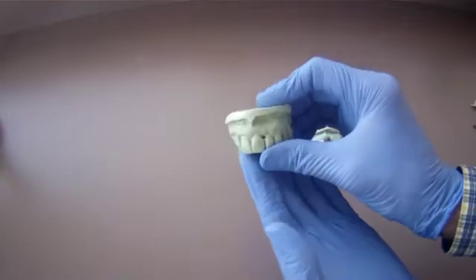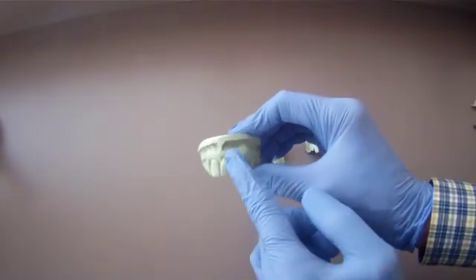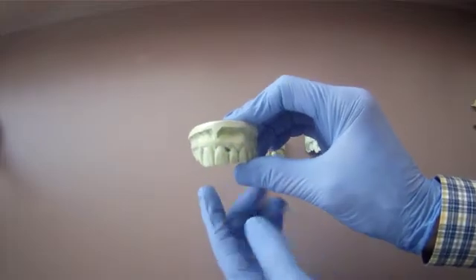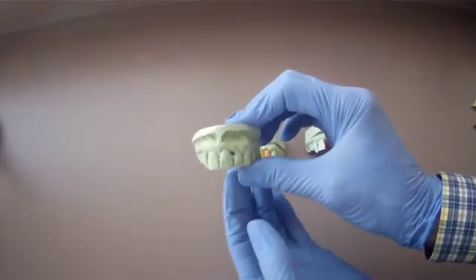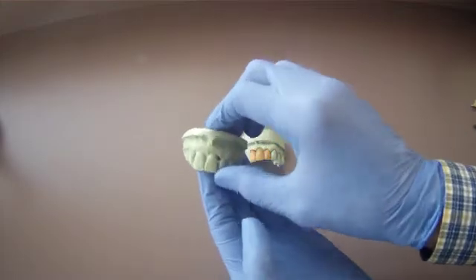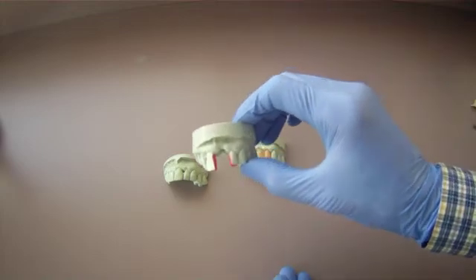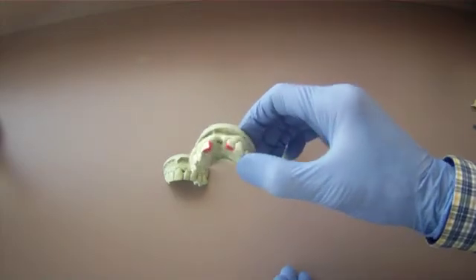This gentleman came into our office in 1996. He had a defect here at the front tooth. It was a gum abscess. We had to extract this central incisor. It's called tooth number 9. And that's what it looked like after we had extracted the tooth.